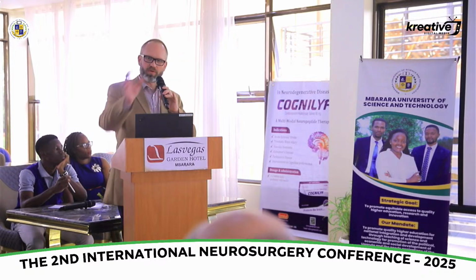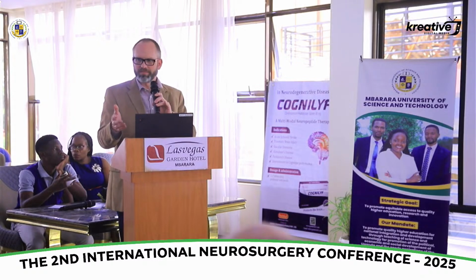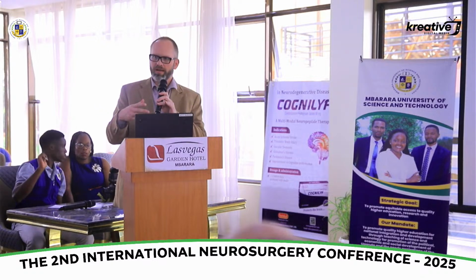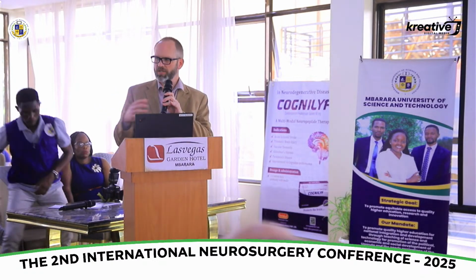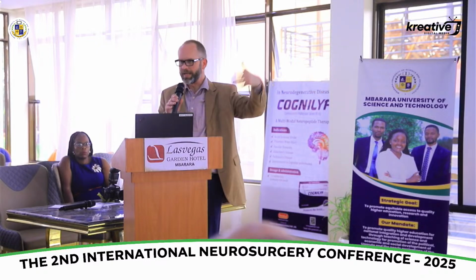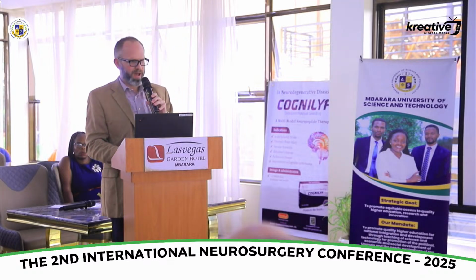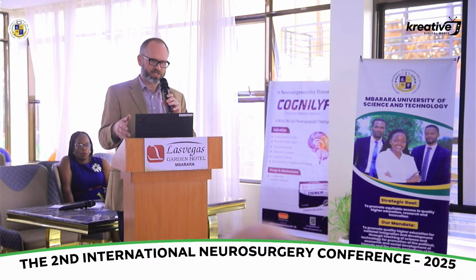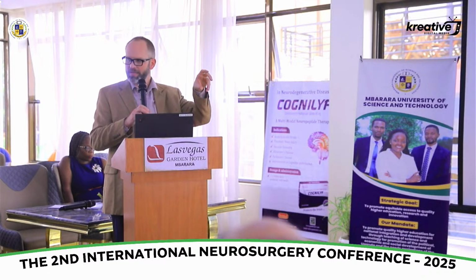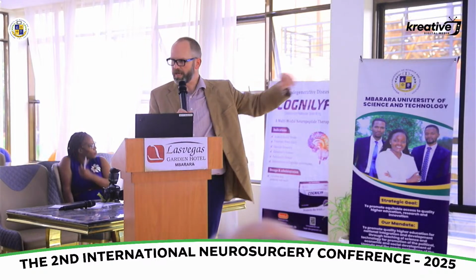You have a preoperative CT or MRI, and then now you've done an operation, and in that operation, now the brain shifts, so none of it's accurate anymore, really, as soon as you start resection. Well, ultrasound doesn't have that problem because after the craniotomy I rely essentially only on ultrasound at this point.